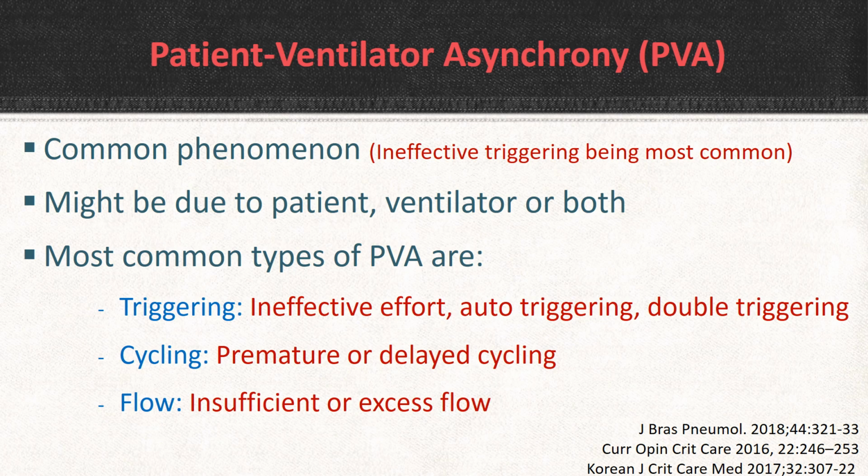So, patient ventilator asynchrony is a discrepancy between patient demand and what the ventilator delivers. If there is no synchrony, then the patient will have patient ventilator asynchrony.